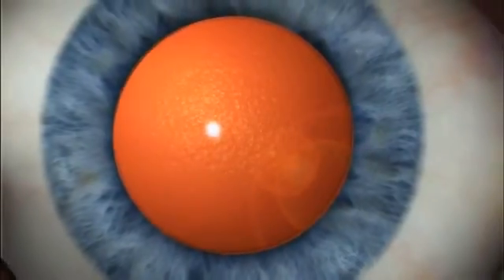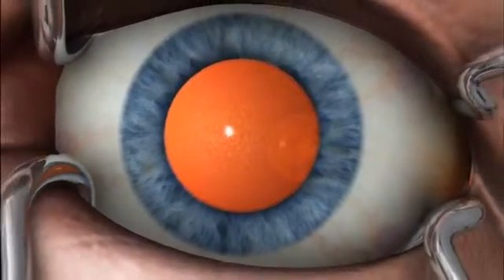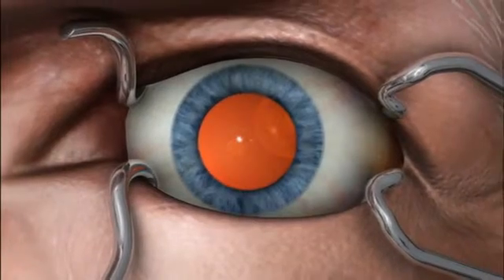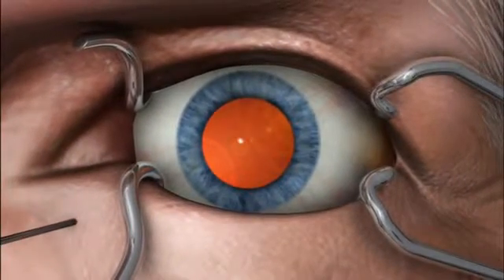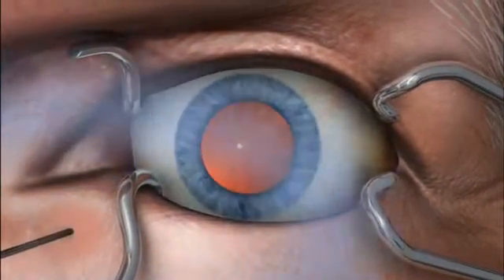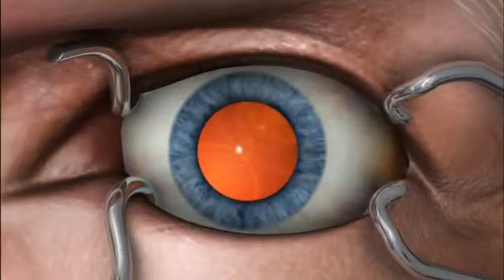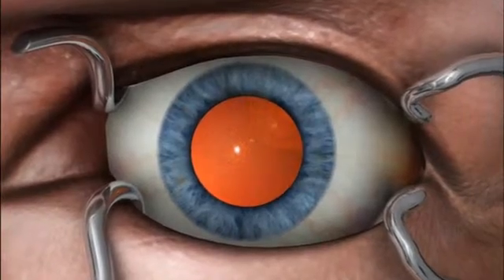To correct this, a doctor may recommend phacoemulsification cataract surgery. Before the procedure, the surgeon numbs the area with anesthesia. Pressure may also be applied to decrease the internal pressure within the eye. This will lower the chances of complications later in the surgery.